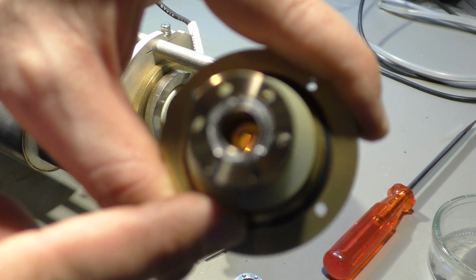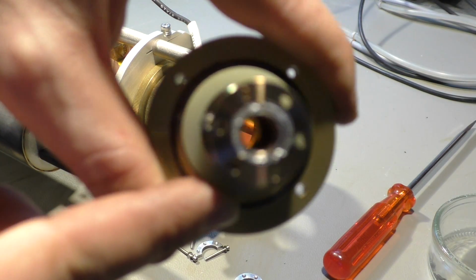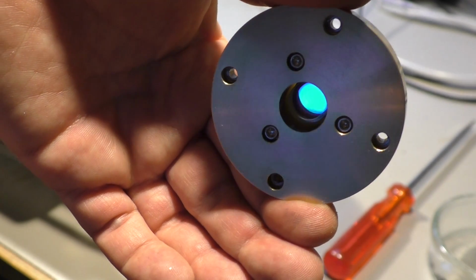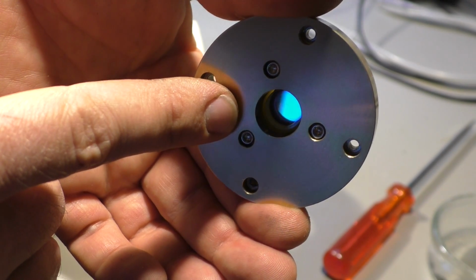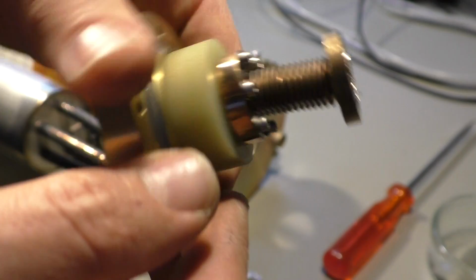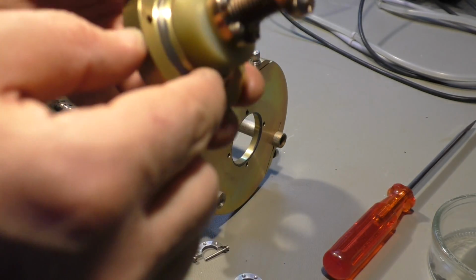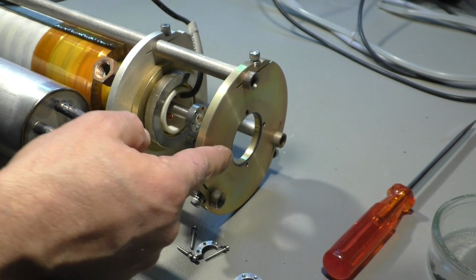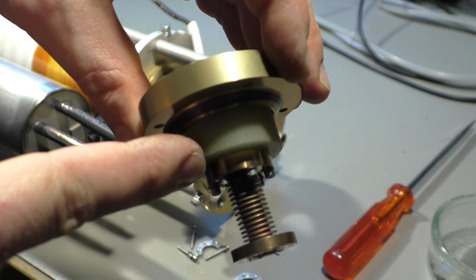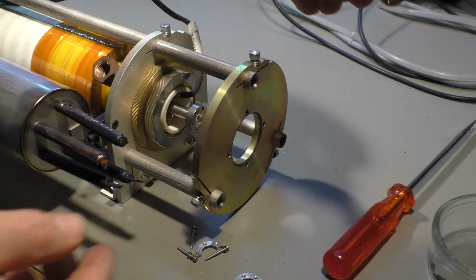You can now see the mirror here. That's the exit mirror or the output mirror. And that's about the color of the laser beam. It's a blue-green color. I think it was about 500, I don't know. I will write it in the comments how many nanometers we have here. Here is some grease to make this part move a little bit easier on that part, and of course insulation, because possibly this part here is under high voltage.